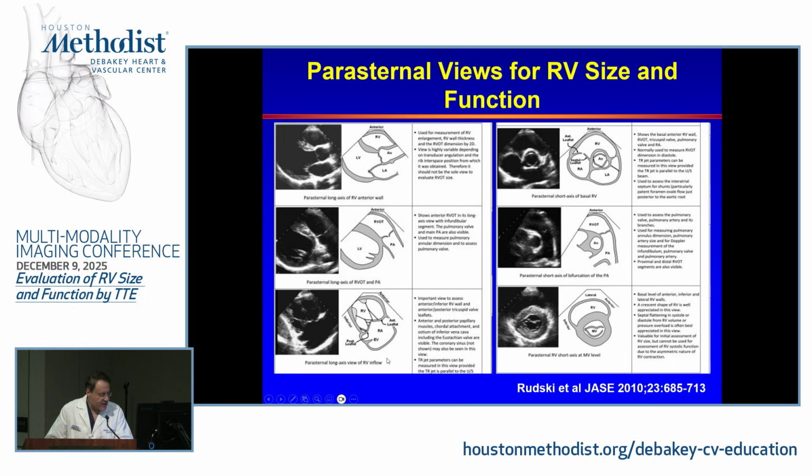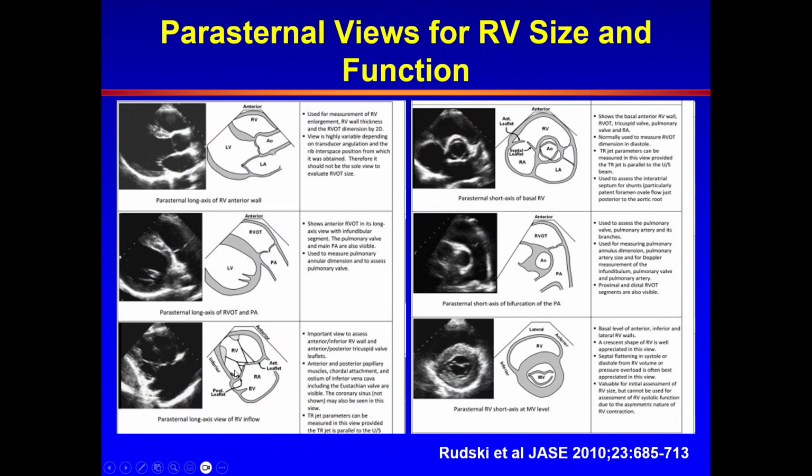And here we get to see the right atrium. We see the anterior leaflet and the septal leaflet. Initially, some thought that this is the posterior leaflet, as in the 2010 guidelines. The guidelines that were published in March this year recognize that leaflet as the septal. We get the anterior wall of the RV, and you can call this the inferior wall, or the wall of the right ventricle that sits on the diaphragm. In patients with coronary artery disease, depending on the distribution of where the disease is, you can see some segments that are performing and others that are not. And that's why we want to look at these walls carefully.